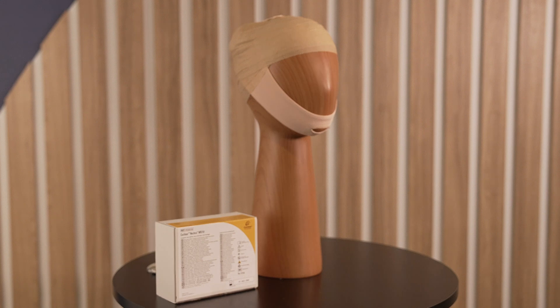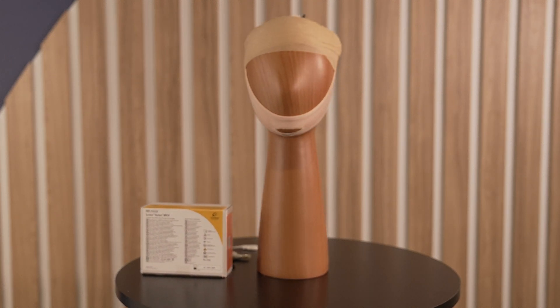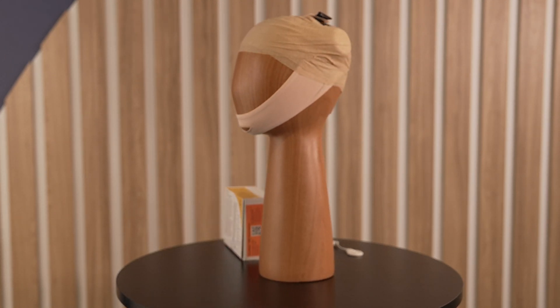Next, conduct the MRI scan. Consult the MRI guidelines for the specific scanning conditions based on the recipient's implant type.